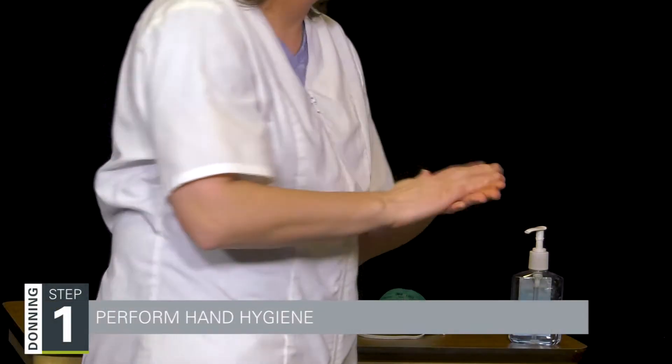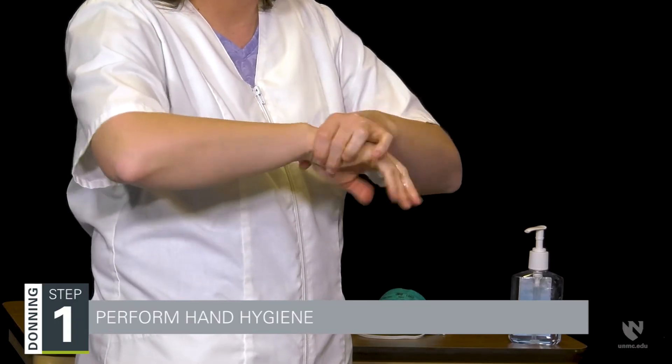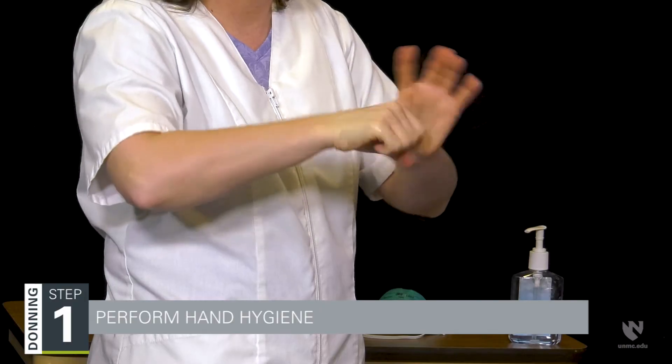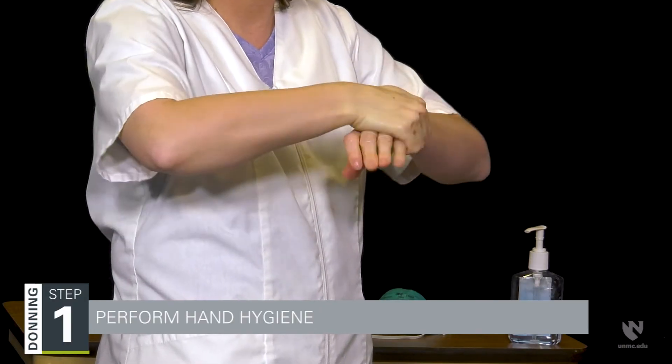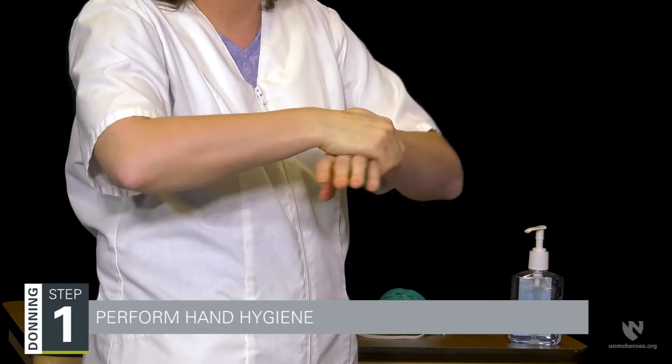The first step in donning an N95 respirator is hand hygiene. Hand hygiene is important to ensure that you are not introducing pathogens from your hands and the environment to your mucous membranes. Alcohol-based hand rubs, or soap and water if hands are visibly contaminated, are both appropriate.